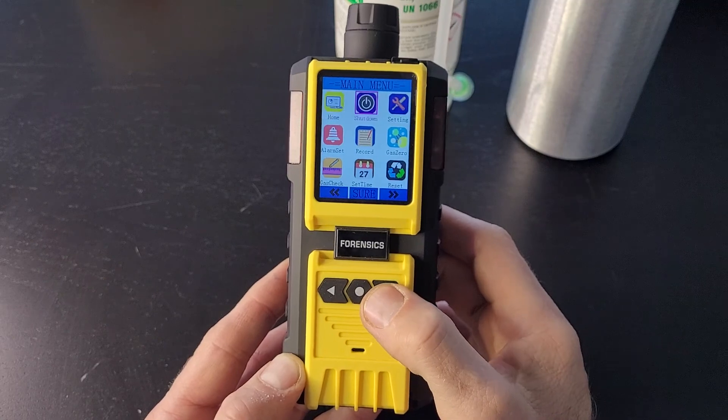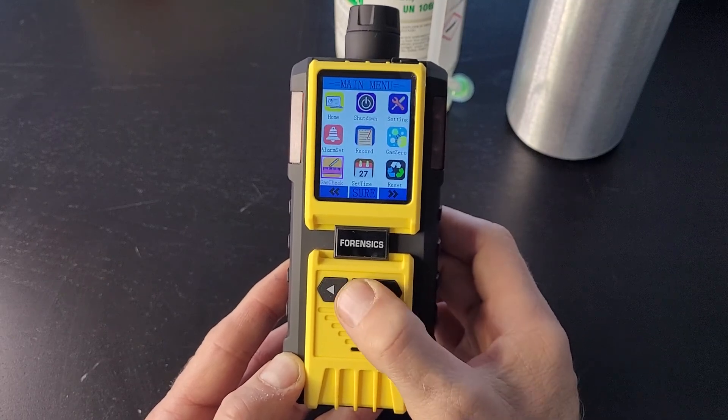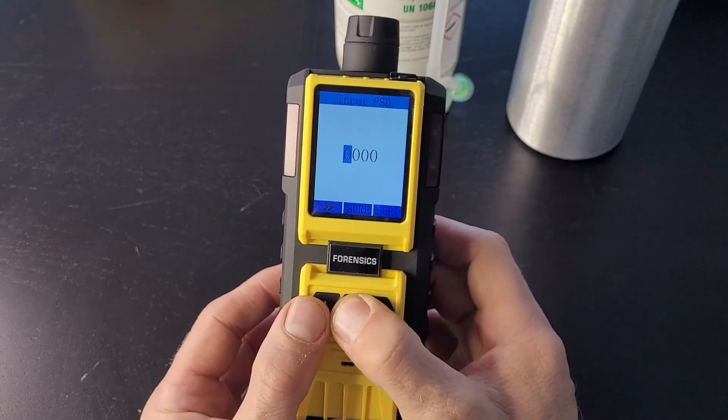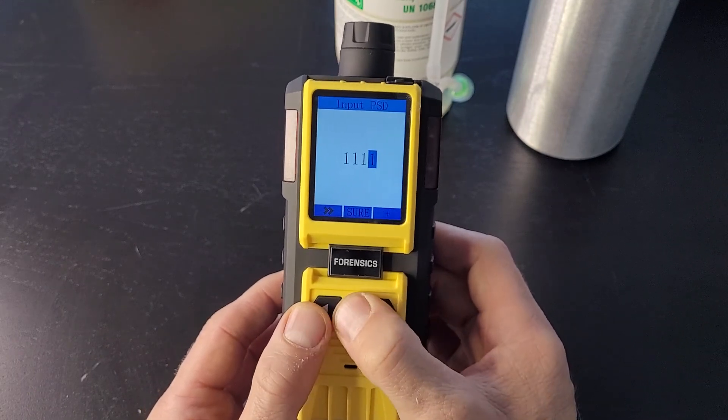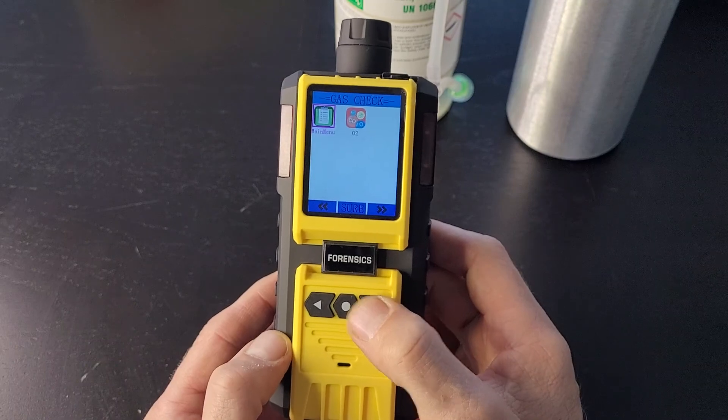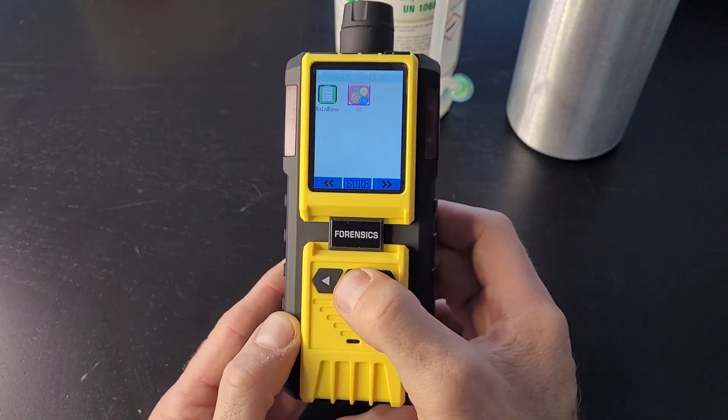So, the way we do it, press menu, go down to gas check, means gas calibration, edit. We're going to pop in our passcode, 1, 1, 1, 1. Select O2, enter.